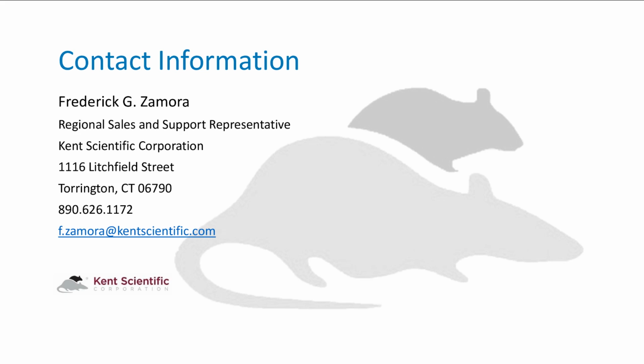Especially if you're the first person to use the system for the day, we usually say to give it up to 5 minutes to make sure that your ISO is flowing through the chamber. Otherwise, if you put your animal directly into the induction chamber and start right off the bat, it might take a minute or a few minutes for it to fill the chamber and get your mouse knocked out.